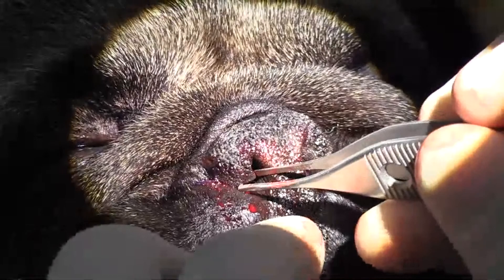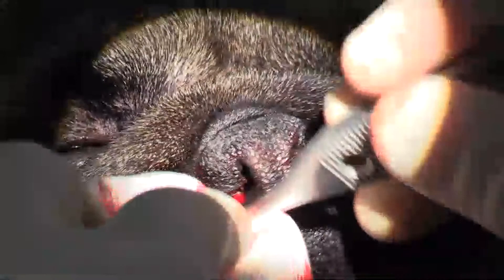I will be doing the soft palate in just a minute. I'm pretty happy with the way that looks — it's symmetrical. Now I'm just going to raise the jaw a little bit so that we can see down into the palate.